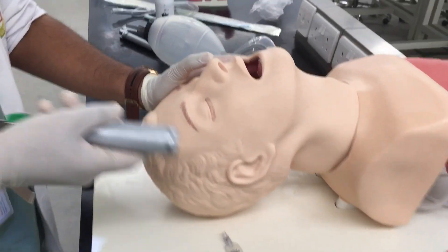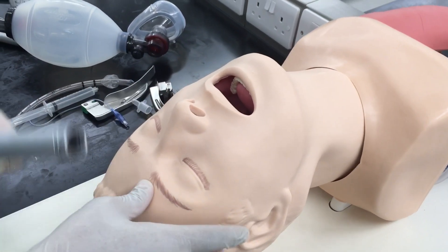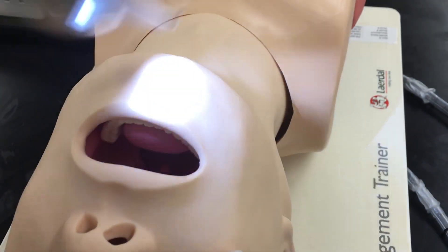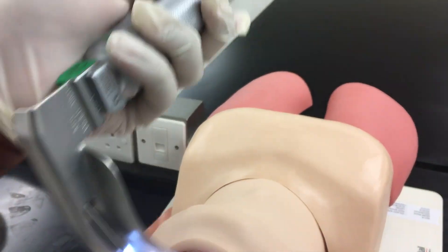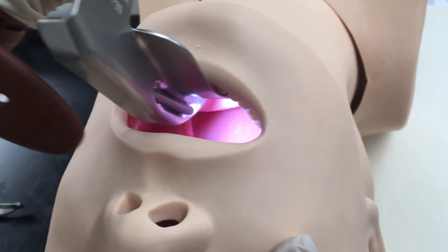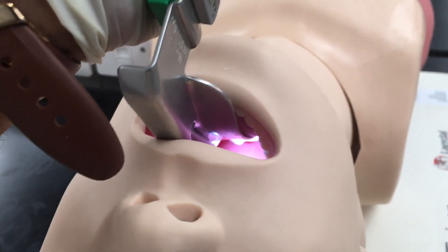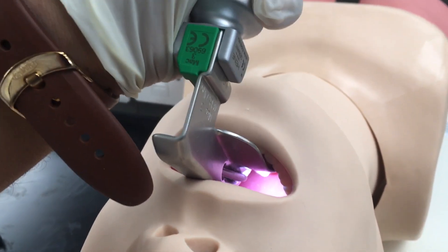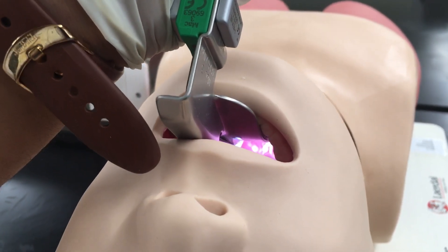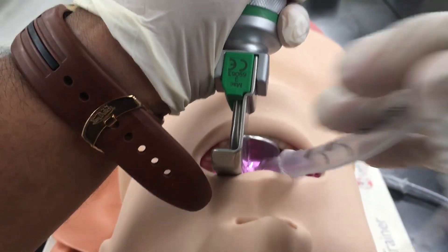After pre-oxygenation, put the patient in the sniffing position — flexion of the lower neck and extension of the upper neck. Hold the blade with your left hand and slide it along the tongue, pushing upward toward the ceiling. Go inside to find the tip of the epiglottis and advance into the vallecula, the space between the tongue and the epiglottis. Once in position, you can see the vocal cords and proceed to intubate using the tube.